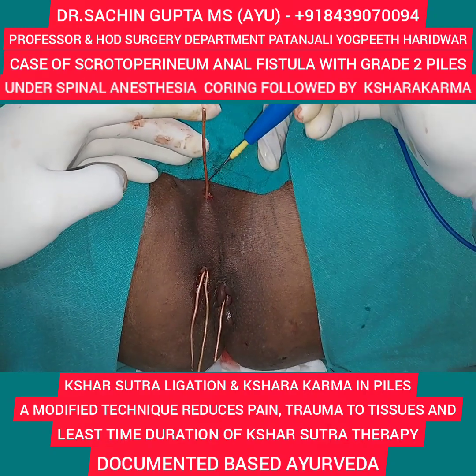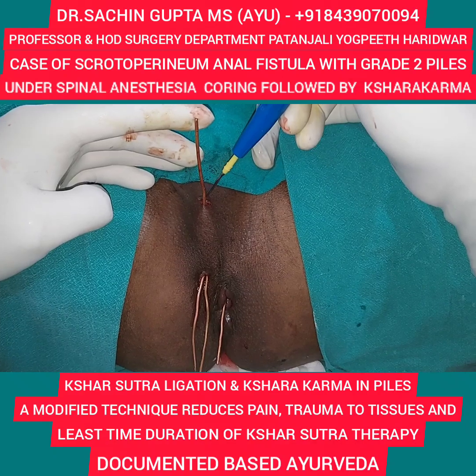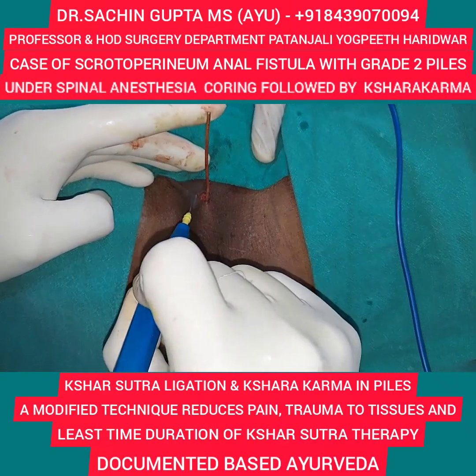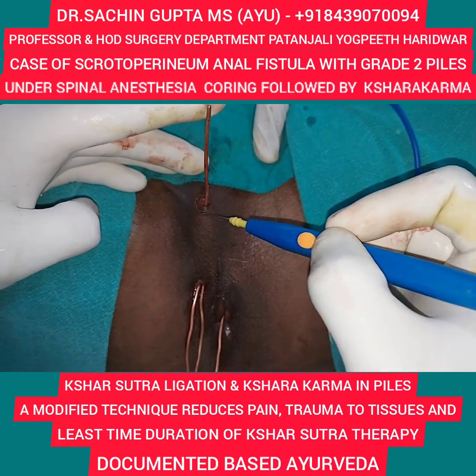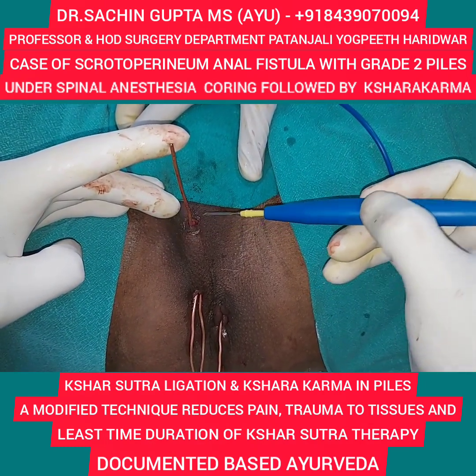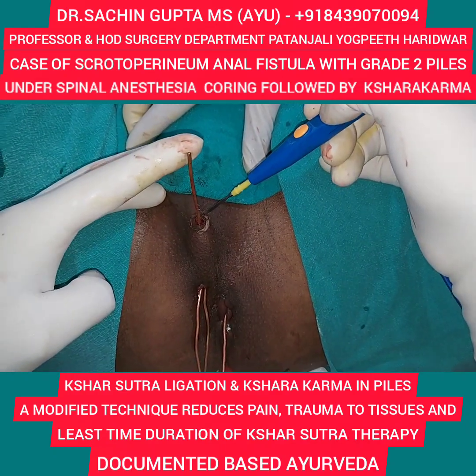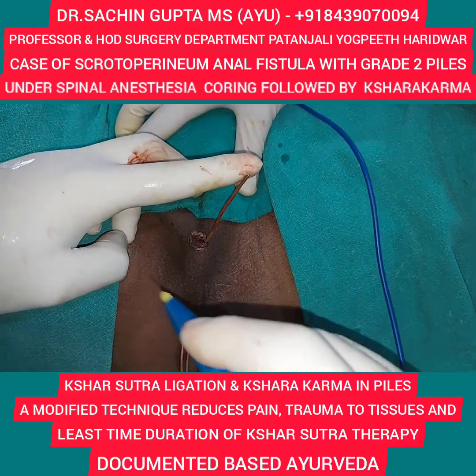So we'll go by a coring method, that is a circumferential incision is taken around the external opening. Do not take a wider incision because it will create a large wound.